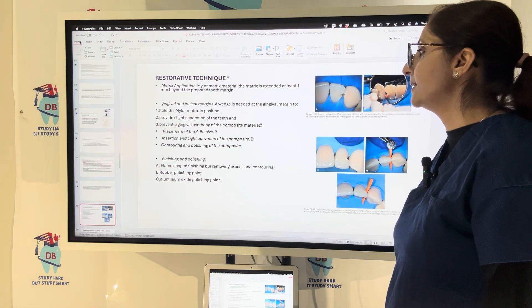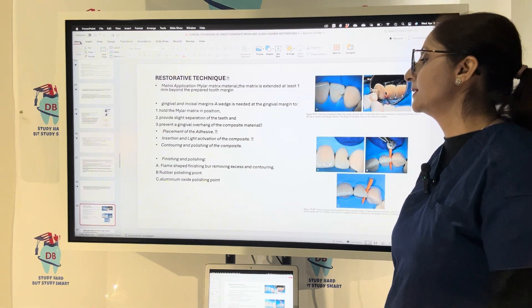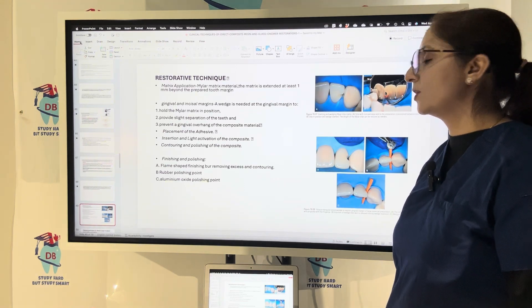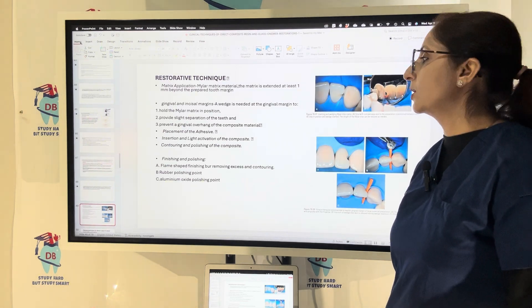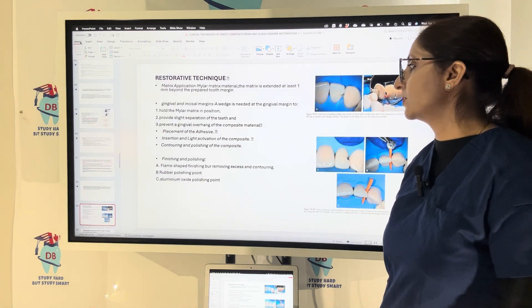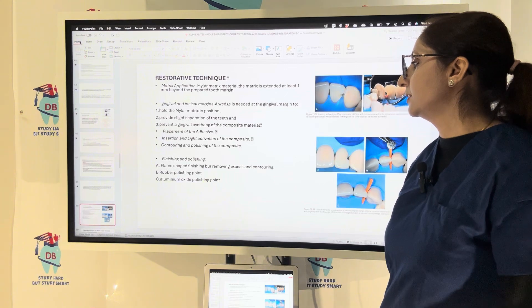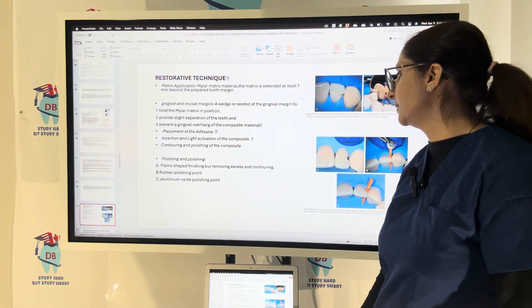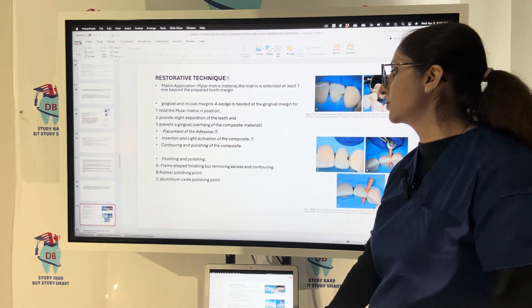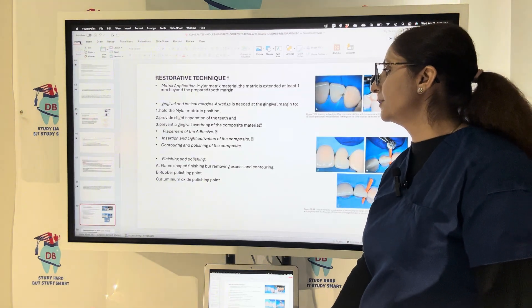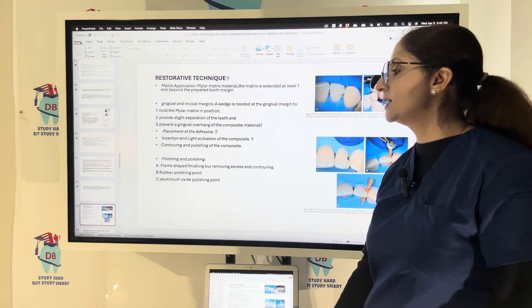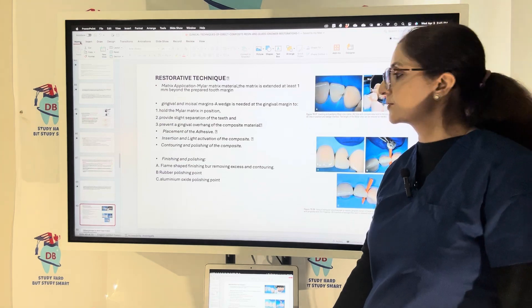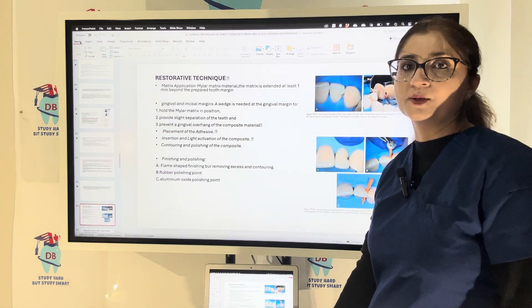Apply the adhesive, insert and light-activate the composite, then contour and polish the composite. Finishing involves a flame-shaped finishing bur for removing excess and contouring, followed by rubber or aluminum oxide polishing points.